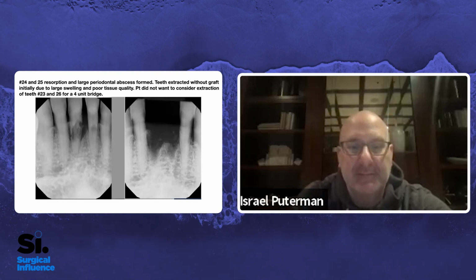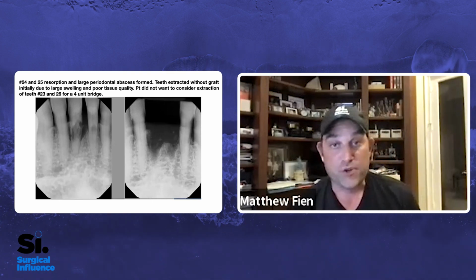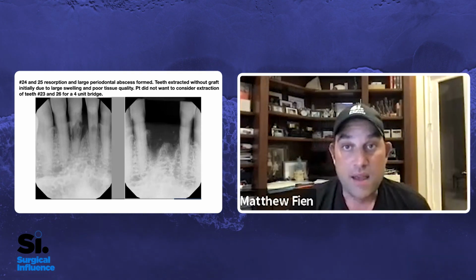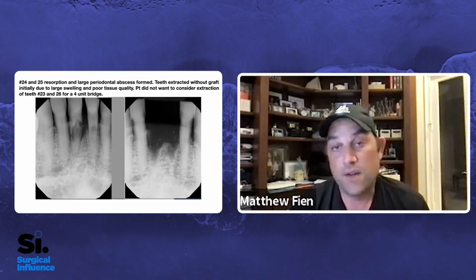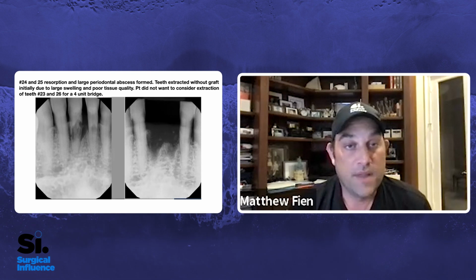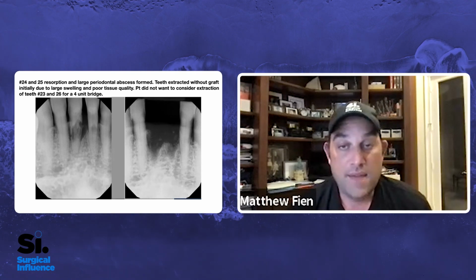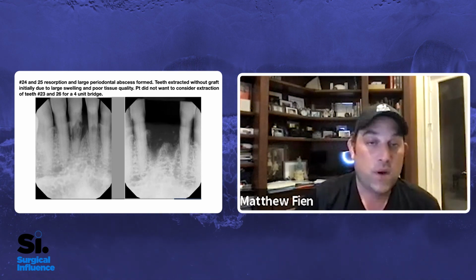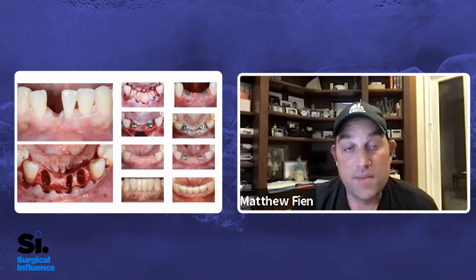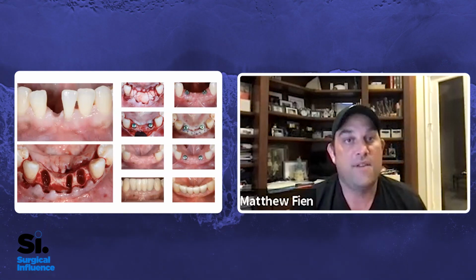Not easy. And now the other thing about this case, I really think this is a key treatment planning case. And I love that the person who submitted the case brought up, yeah, sure, we could go for a 4-unit bridge. And that could be a tooth-borne bridge or maybe even a 4-unit implant bridge. And I'm going to show an example of that where I was faced with that decision myself.